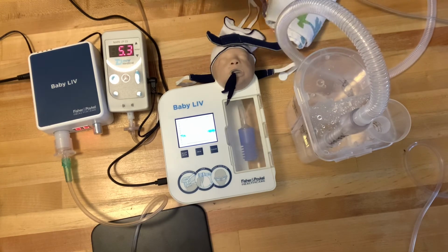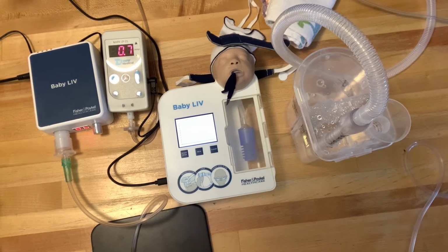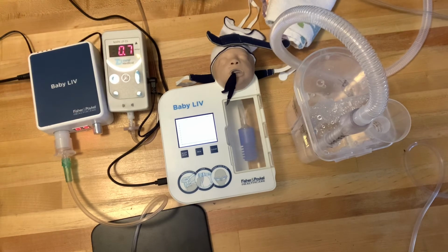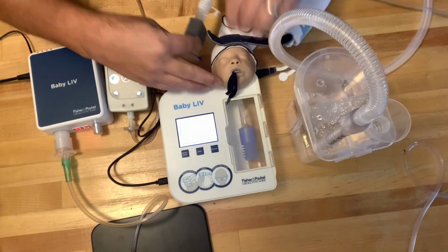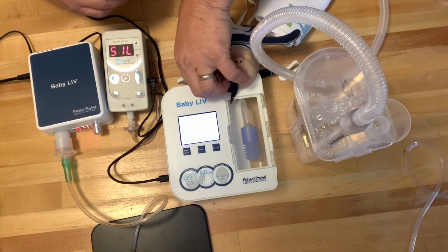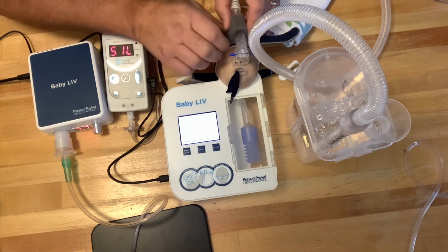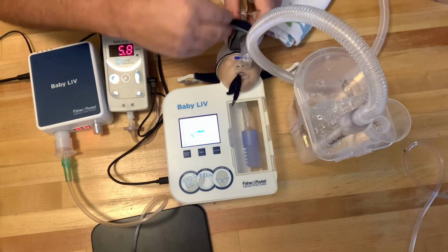What happens when water builds up in a bubble CPAP line? And we get this a lot. Go ahead and turn off this alarm. We get this a lot when the bubbler is raised high on the bed. On the baby, the expiratory limb gets a U-bend in it and can start collecting moisture. So I get questions on, does that moisture have an impact on the baby's pressure?